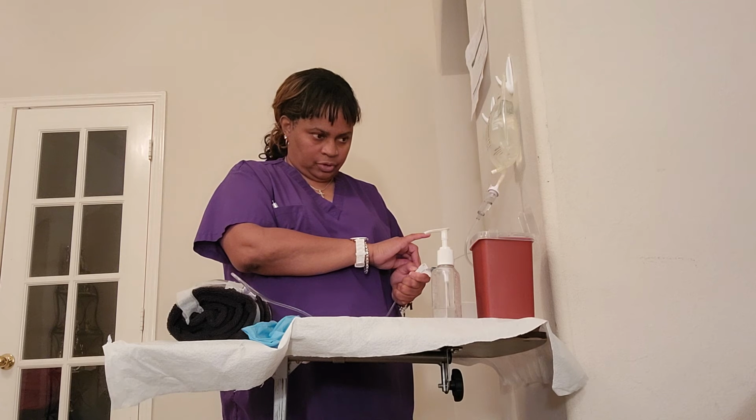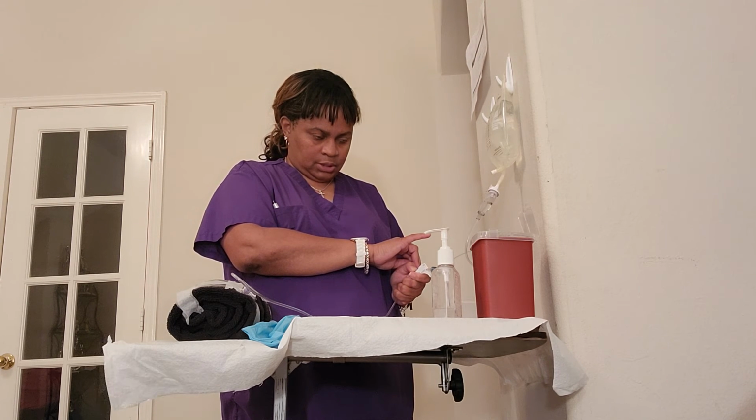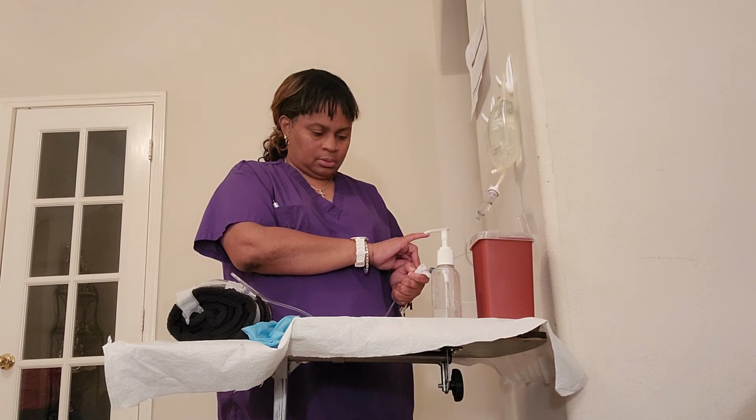Okay, and I shall start counting it right now.